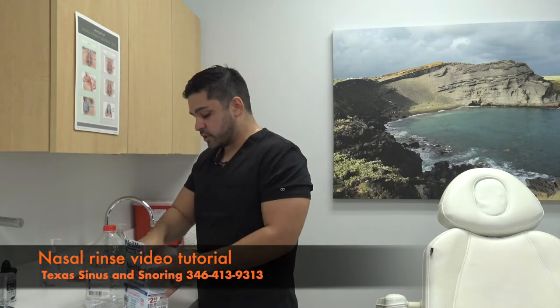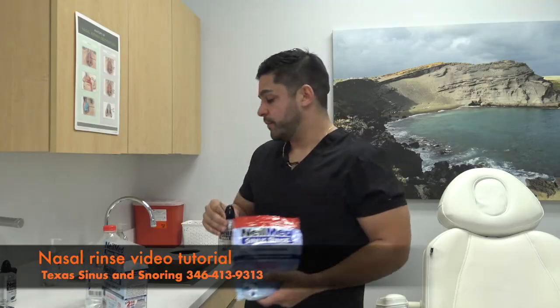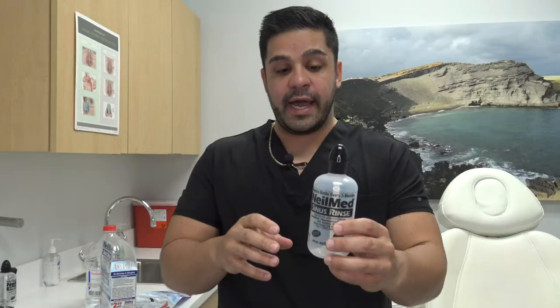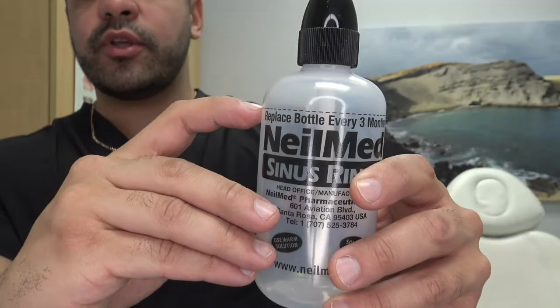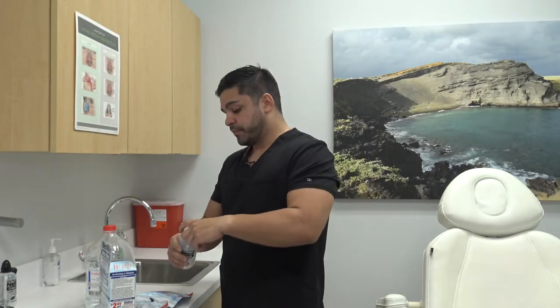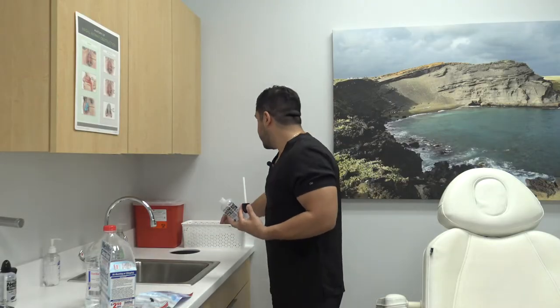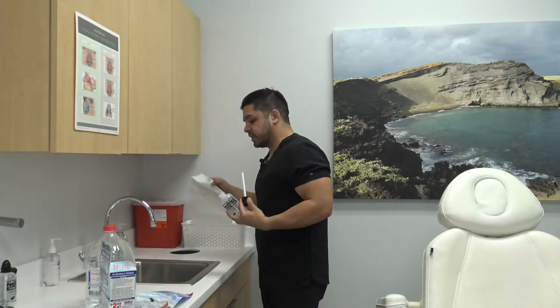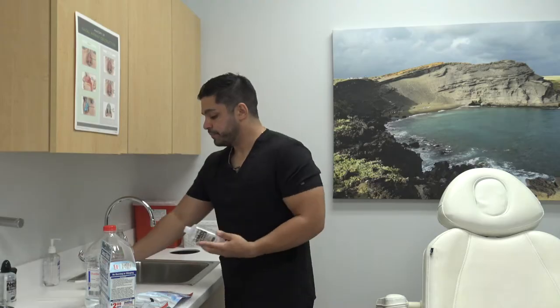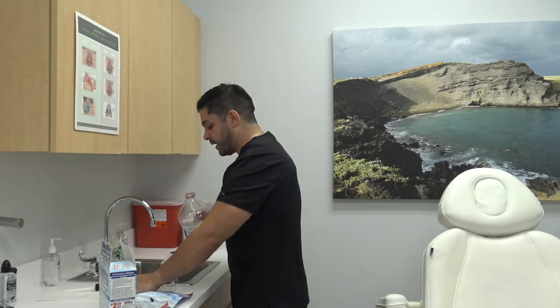Inside of this package you'll find salt packets as well as the actual bottle. As you can see, the bottle has a black line right here and this is where you will be filling it up with distilled water. Bottled water is okay if you're traveling, but distilled water is preferred. First, take the cap out and lay it somewhere clean, then fill the bottle all the way up to the black line.